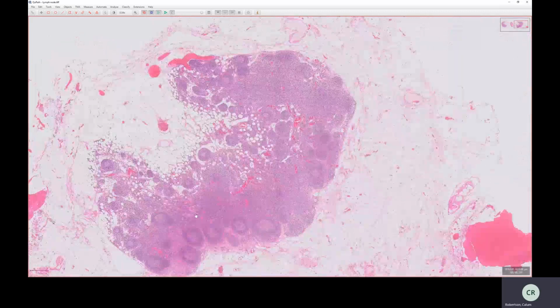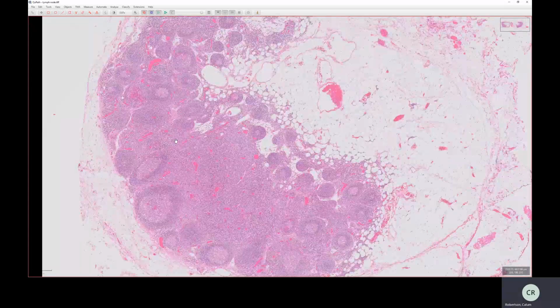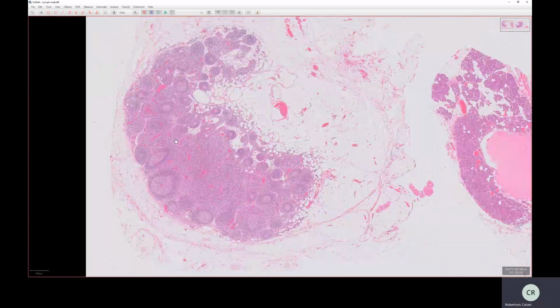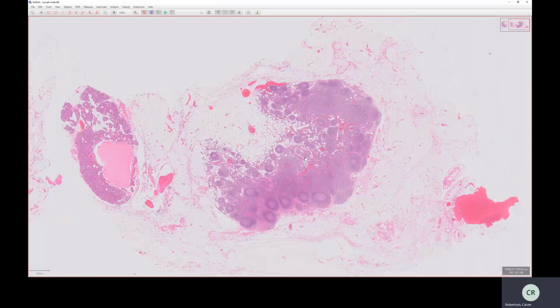and that's a kind of beginner's guide to lymph node architecture. And there's lots to talk about within lymph nodes, a lot more than what I have gone through here. But I think this will do you for an introduction.